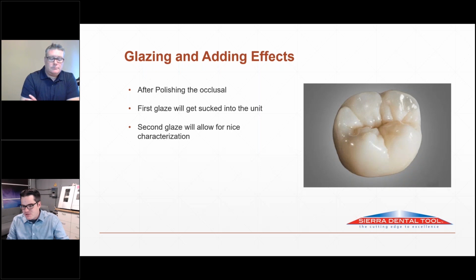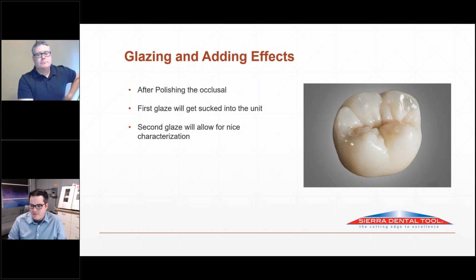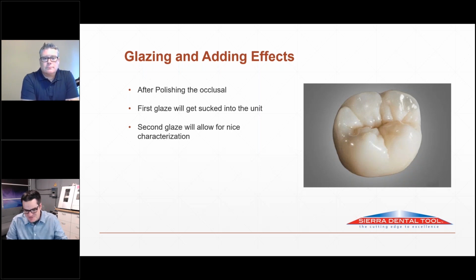And so that should be a goal that everybody has, and if you're active, looking on Facebook and other webinars that Zahn puts on, it's pretty clear that labs are getting really good results out there with zirconia. The materials are wonderful. When I first started with zirconia, it was a nasty looking crown. I mean, they worked. It's a gold crown replacement was the marketing. You don't have the gold, but it's going to function, right?